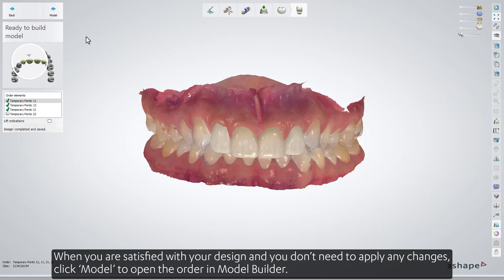When you are satisfied with your design and don't need to apply any changes, click Model to open the order in Model Builder.